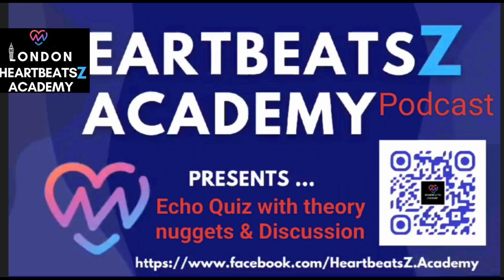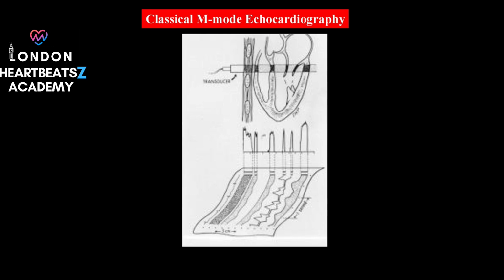Today, we're diving into the world of M-mode echocardiography. You might be thinking, M-mode? Isn't that a bit old school? And you'd be right. It's been around for a while, but we're here to explore why this technique, despite its age, is still so relevant and even essential in cardiology today. I think it's really cool. What's really intriguing is that M-mode gives us a unique perspective on the heart's movements, something that even the most sophisticated 2D and 3D imaging techniques can't quite replicate.